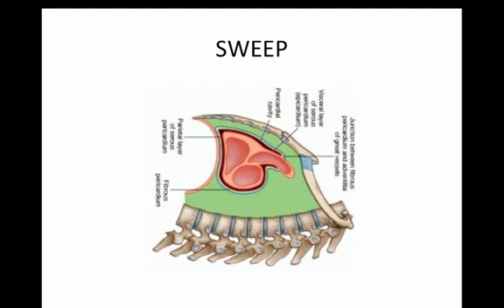Here is the heart placed in the supine position. Small amounts of pericardial fluid can accumulate in this area posteriorly. Now, let's say we have an ultrasound probe about here. We can see that the plane of its beam here will actually not intersect where that effusion is.